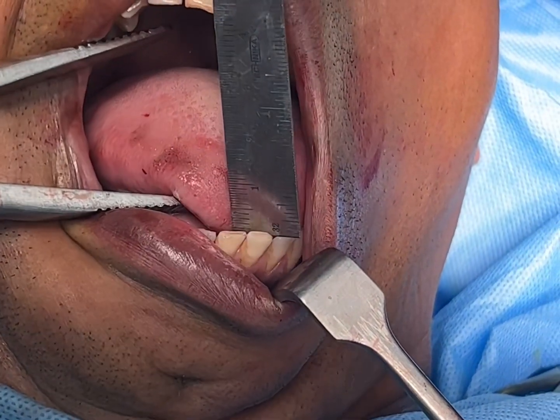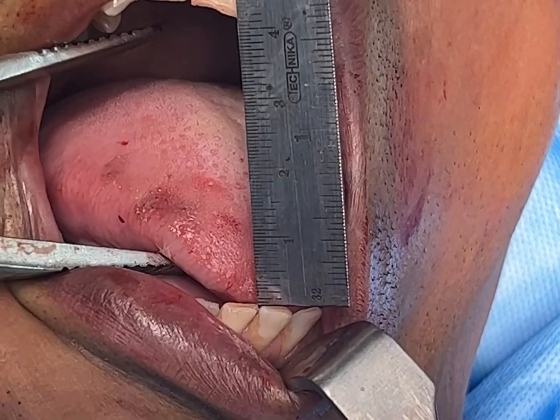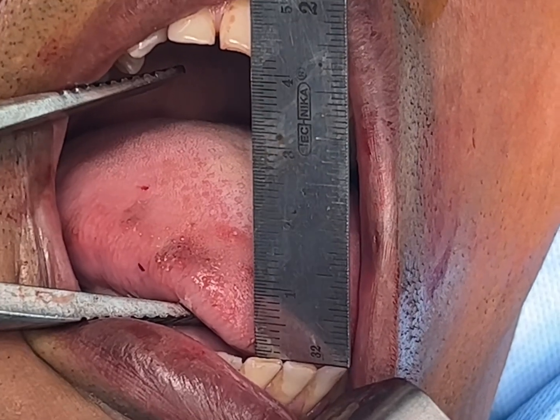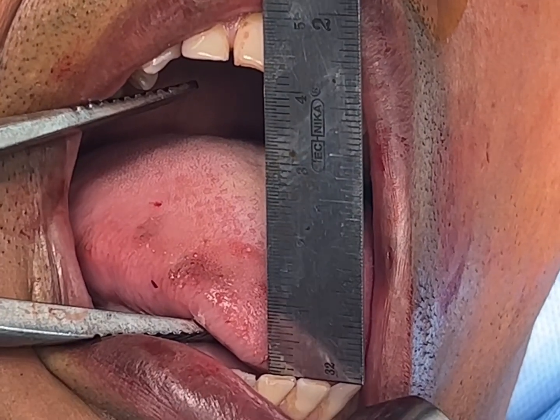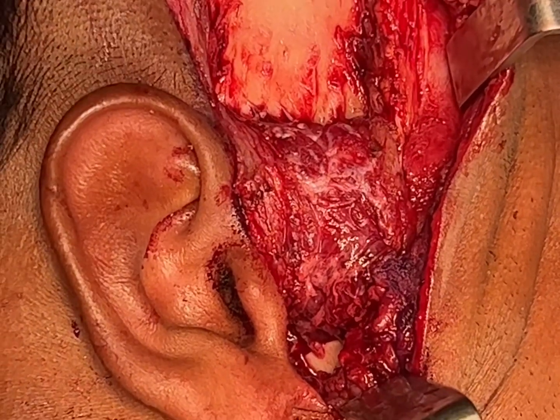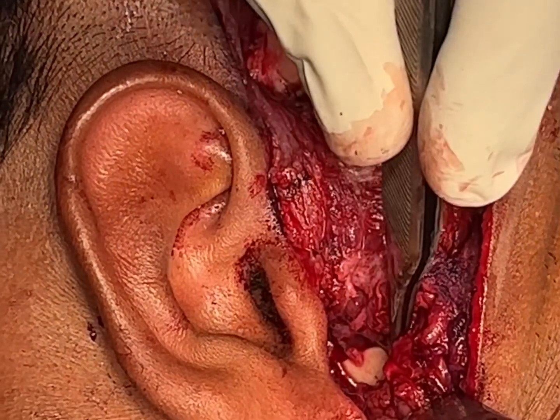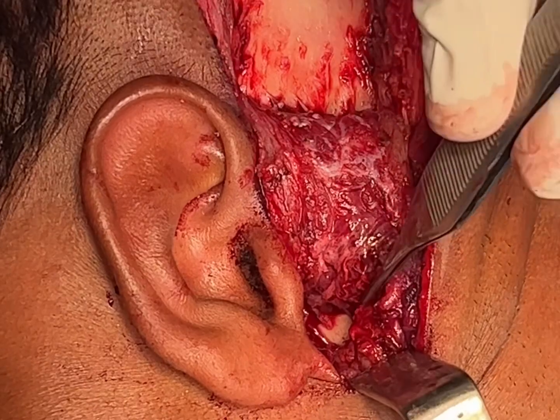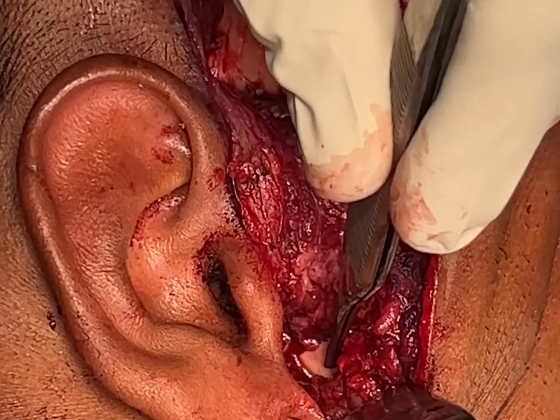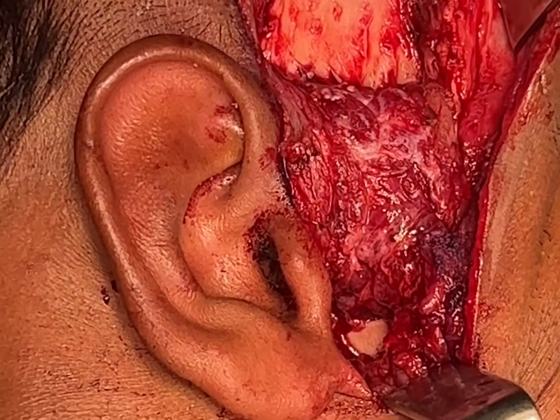The mouth opening we've achieved with this surgery is just over four centimeters as shown with the scale — quite a lot. Even with a 10% decrease over the next few weeks post-surgery, we'll still be left with about 3.5 centimeters of mouth opening, which is normal. The temporal muscle has been raised, turned around, and fixed to form the pseudo joint, preventing the remaining mandible ramus from fusing with the skull base in the future.